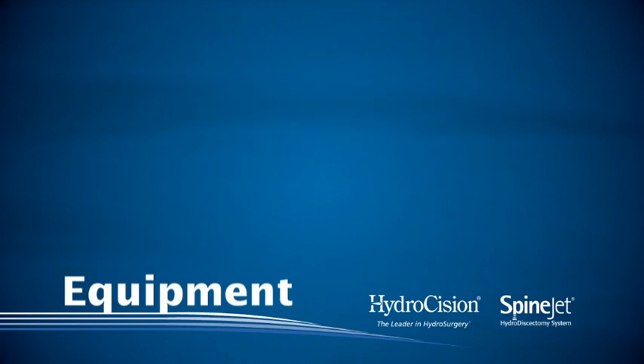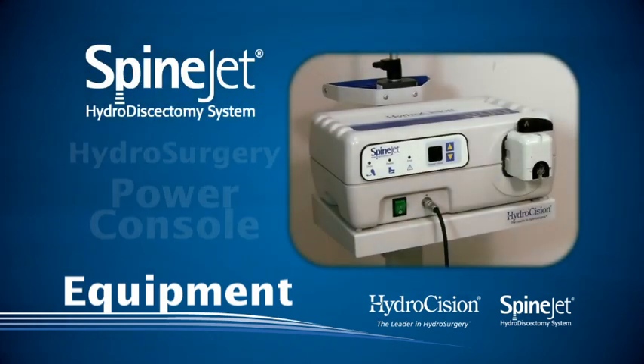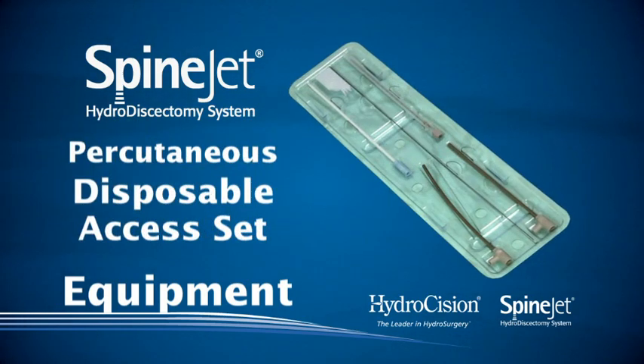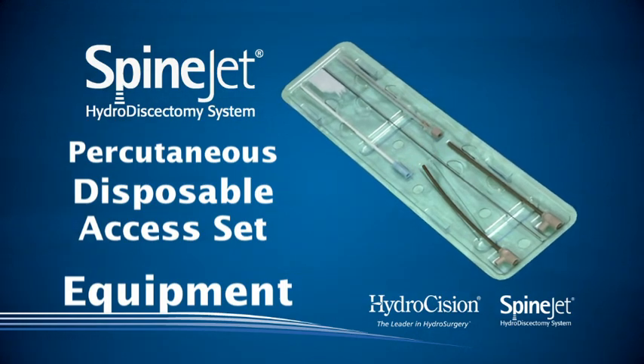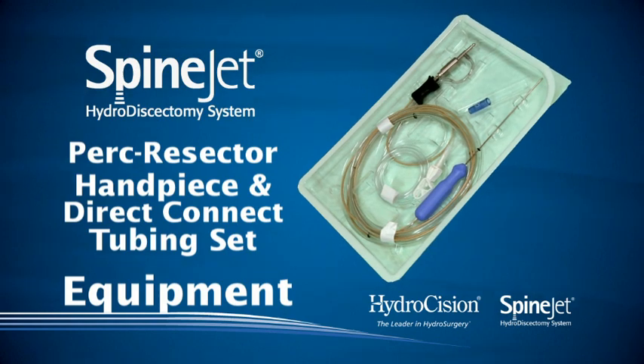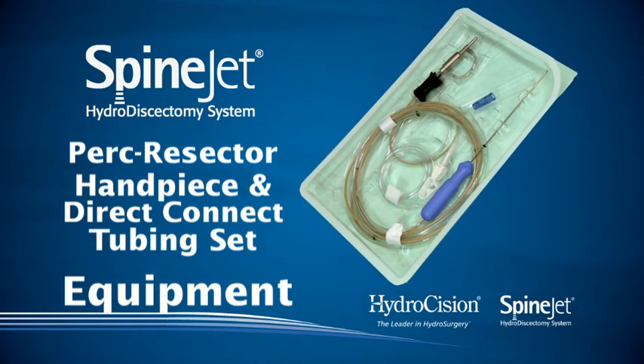The equipment used to perform this procedure includes the SpineJet Hydrosurgery Power Console, the SpineJet Percutaneous Disposable Access Set, and the SpineJet PERC Receptor Handpiece and Direct Connect Tubing Set.